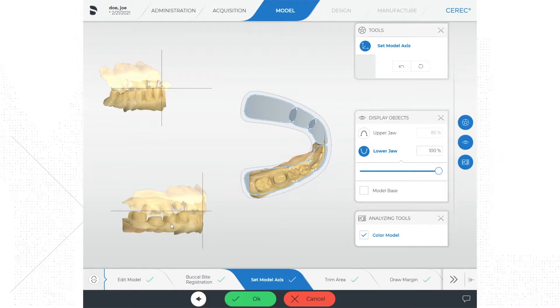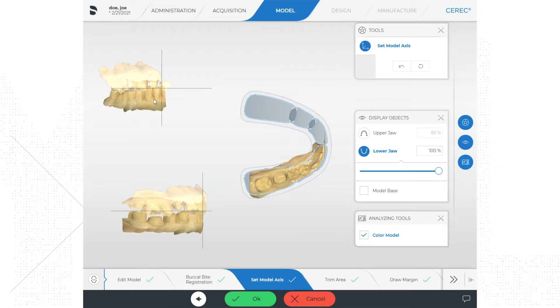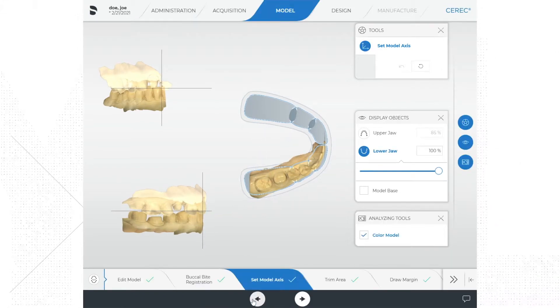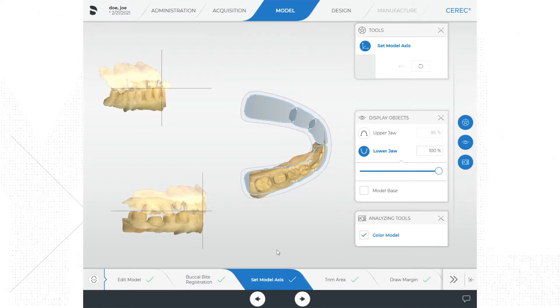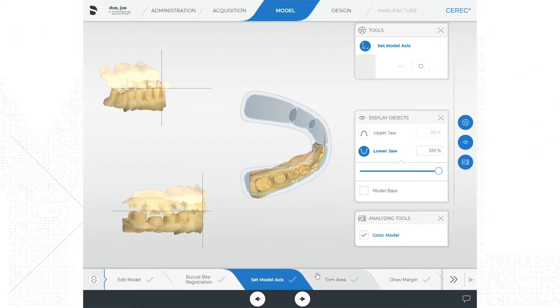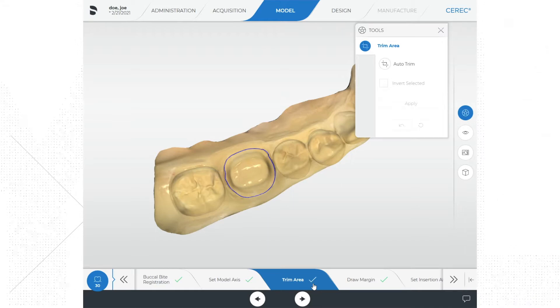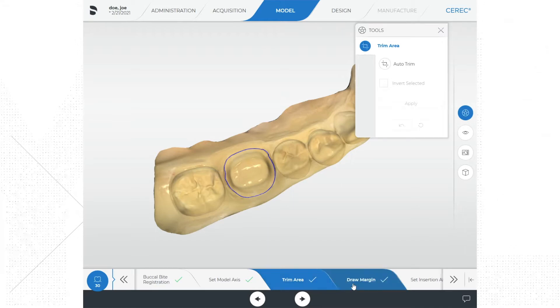Setting the model axis is a critical step if you are using the virtual articulator with your case. Once I have all three angles or views of the model set, I'm ready to click OK at the bottom of the screen and progress to the next step. Truthfully, based on what I initially saw, we could have likely just left this alone based on the auto adjustments. Trimming the model used to be an optional step — on my screen it goes ahead and completes that step automatically. If I choose not to trim the model, the next step is to draw the margin.